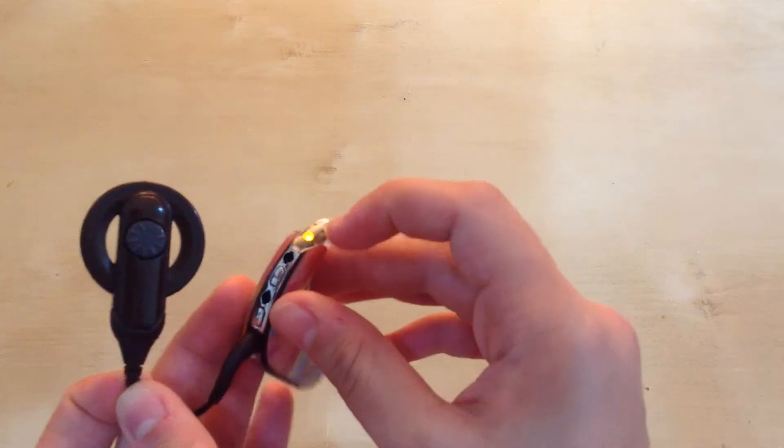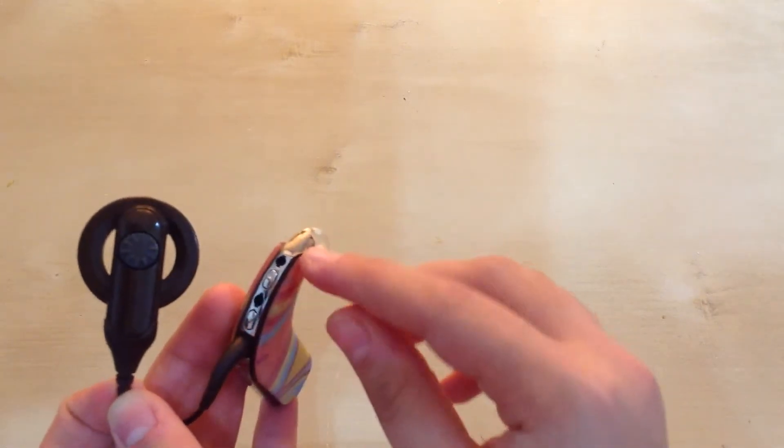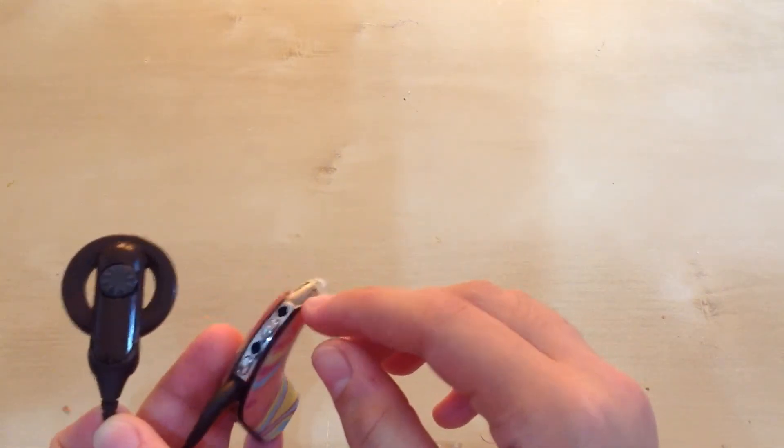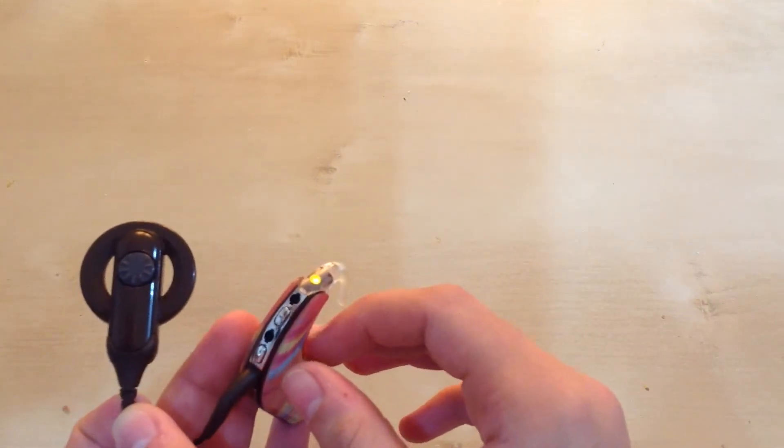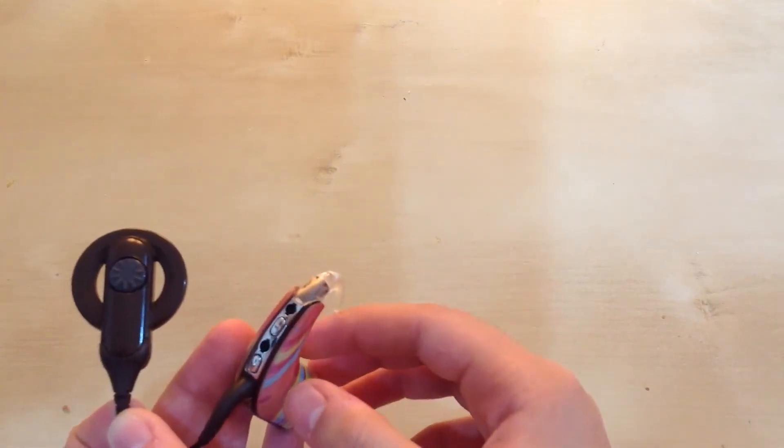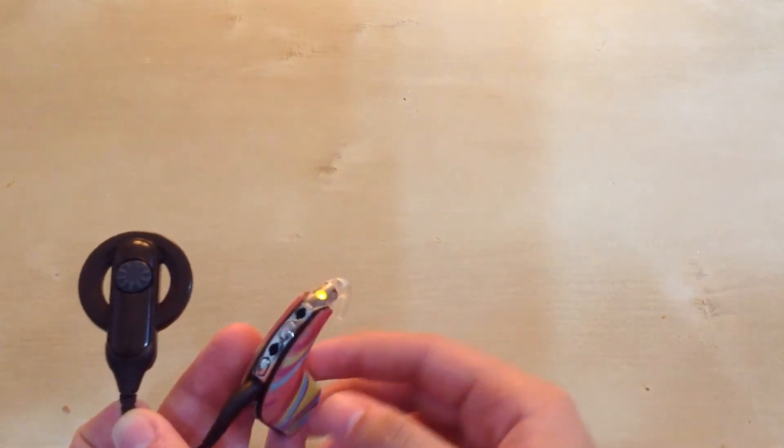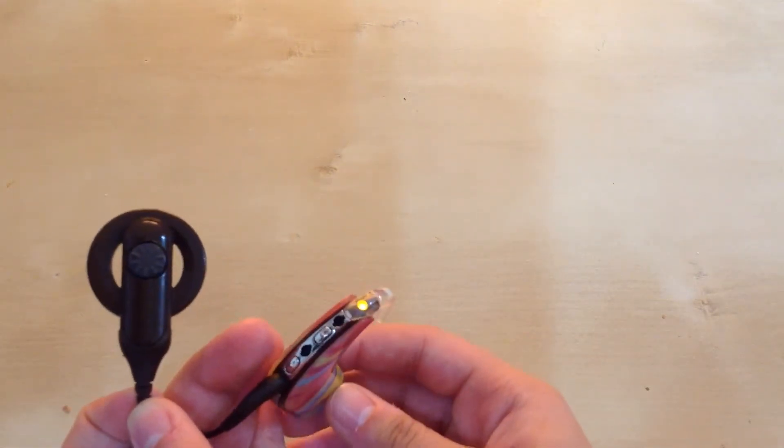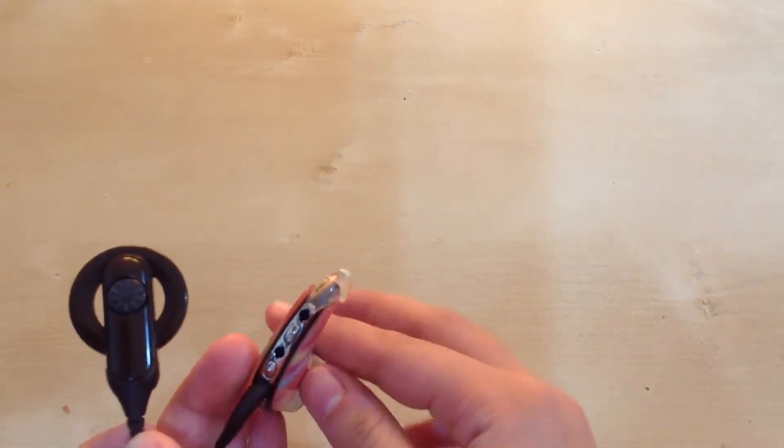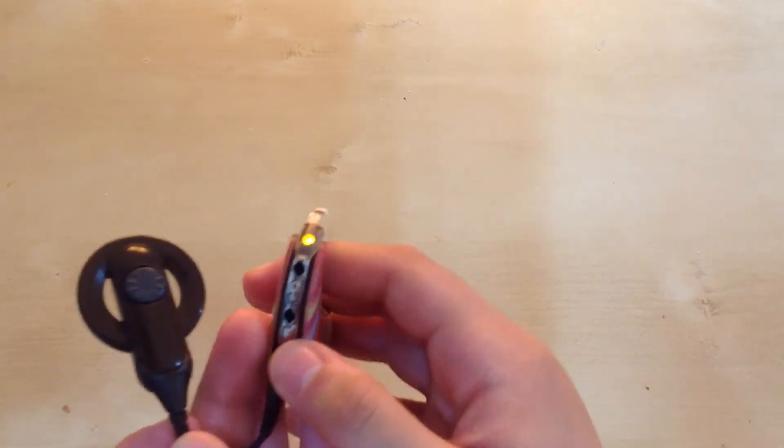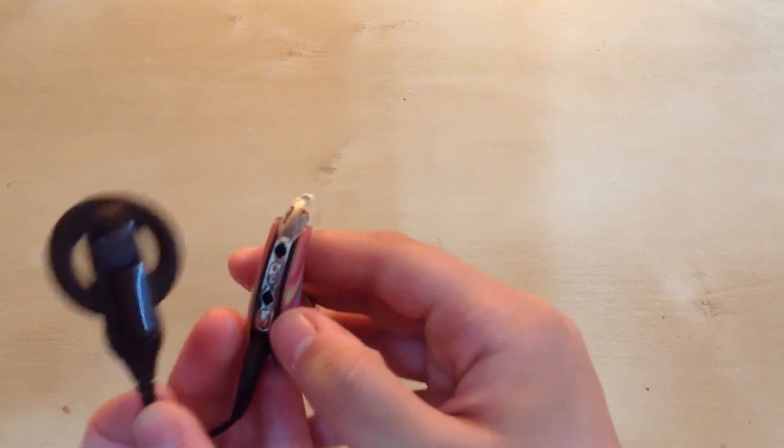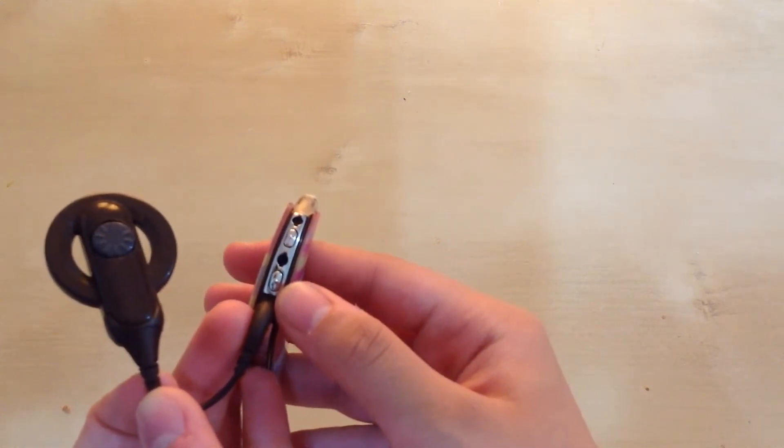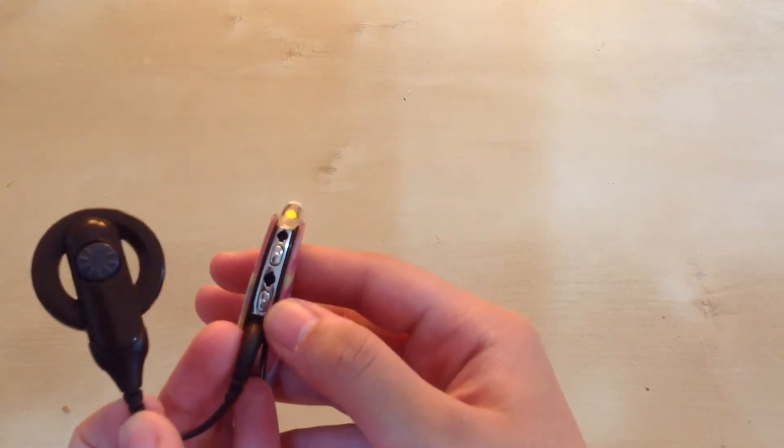This button, the bottom button, can also be used for changing the programs of the processor. If you press it for less than three seconds, just for like a second, then it'll change the program.